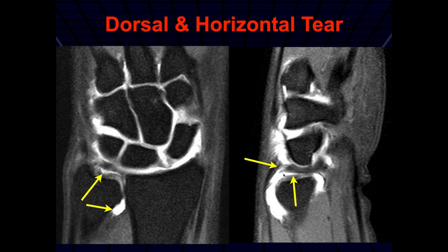So this is both a horizontal and a vertical component tear of the dorsal aspect of the disc. And a scapholunate ligament tear — this was the membranous portion — but we can see there's some diastasis and a type two lunate.